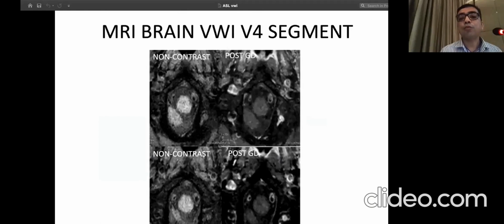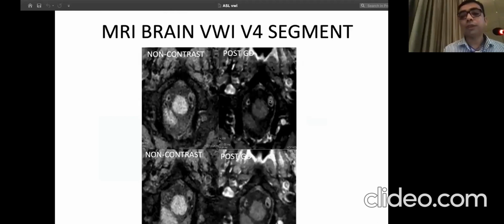When we moved up the intracranial circulation, where the artery pierces the dura, that's a location where vessel wall imaging shows artifacts. You can have abnormal enhancement there, but on our repeated sequences up and down, we see the plaque hanging there with an ulceration, obstructing the lumen. So we started this treatment.